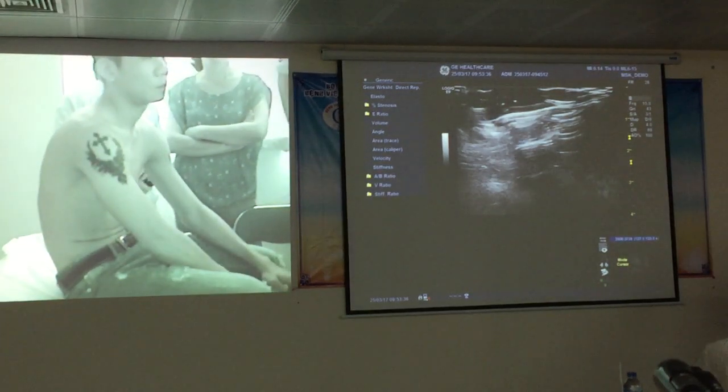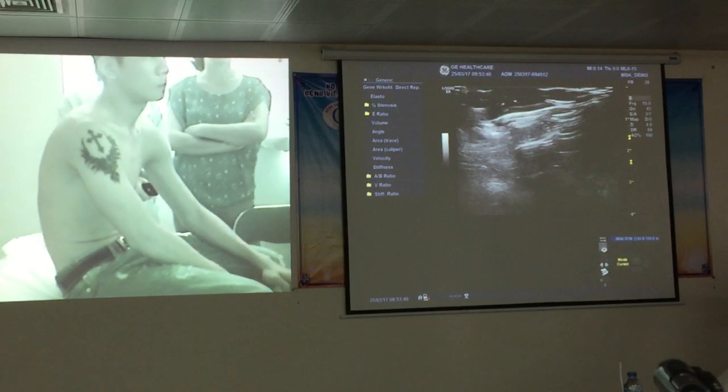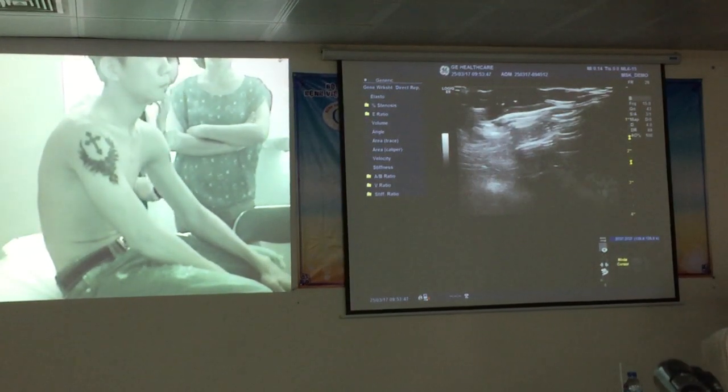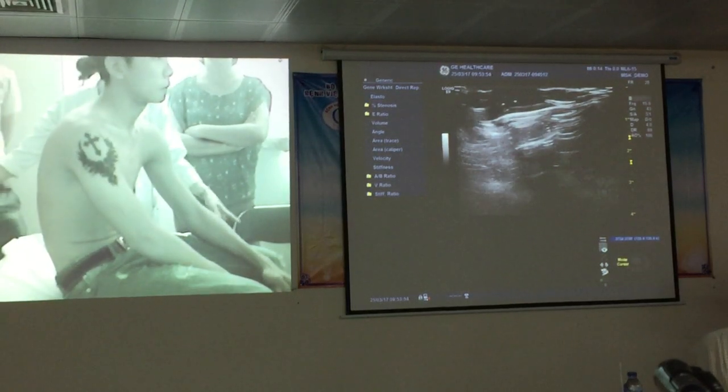Rồi tôi sẽ đặt bệnh nhân lên trên một cái ghế mà có thể di chuyển, điều chỉnh được cái độ cao của bệnh nhân để phù hợp với cái tay làm. But you can do the patient just sitting on a chair in front of you or wherever you're more comfortable scanning. Hoặc là bạn có thể đặt bệnh nhân ngồi ở trước mặt mình hoặc là ở một cái vị trí xoay gì đó mà mình làm thì phù hợp được.